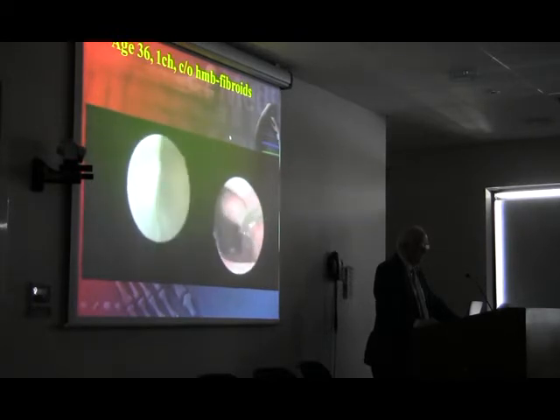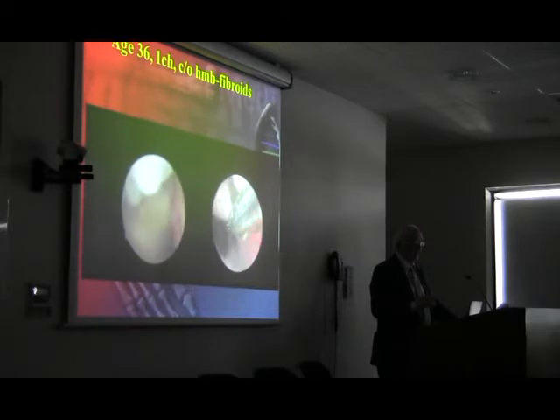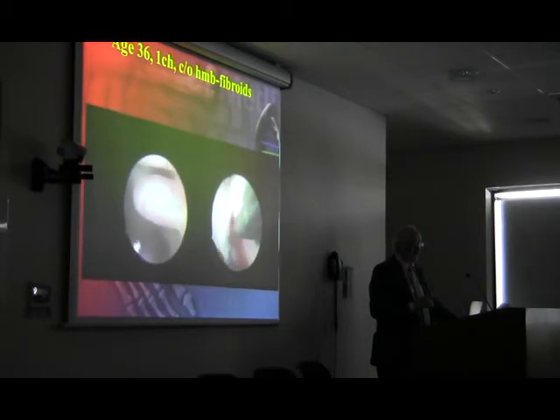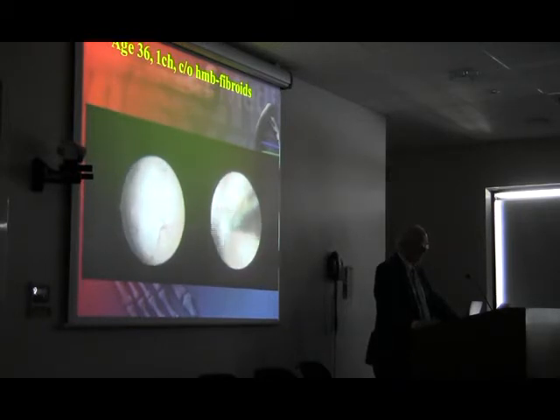Now, in this patient, she had a little polyp on one side. And we can just see the little scissors. Now, she's not going to feel that scissors cutting. You've got to tell her you're not going to feel this. And you just cut it off with this. So it's quite an easy procedure with the little scissors and grasper.